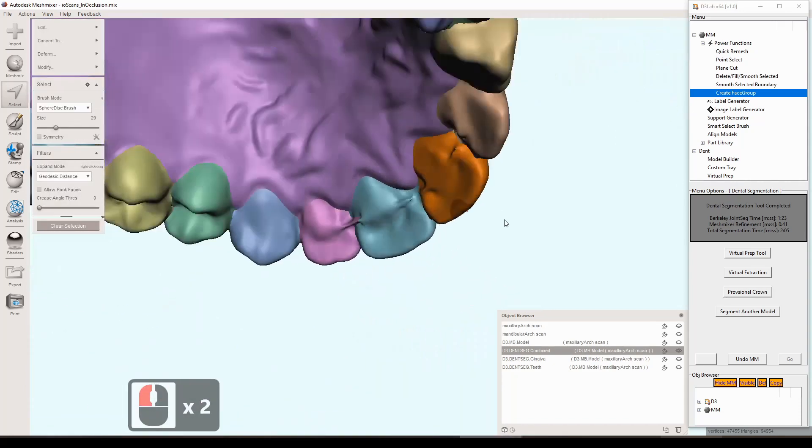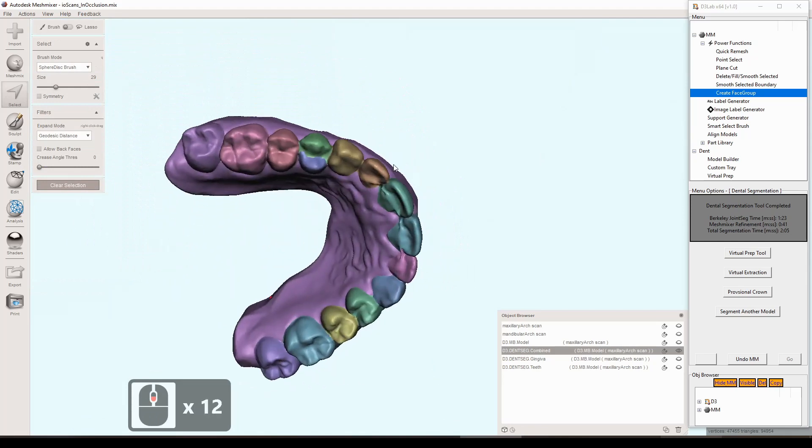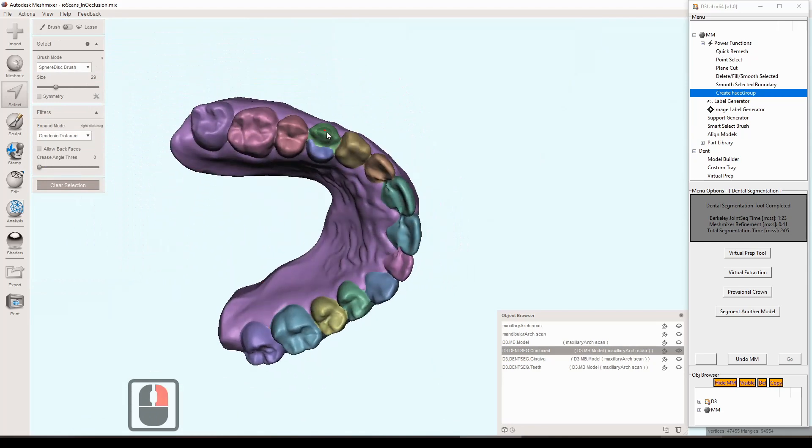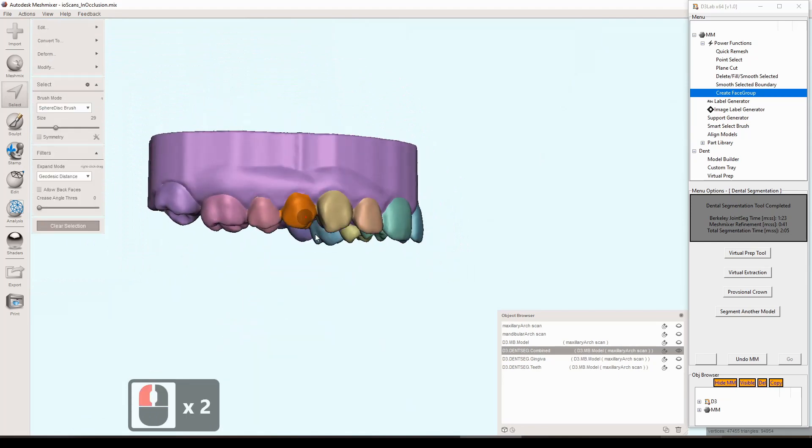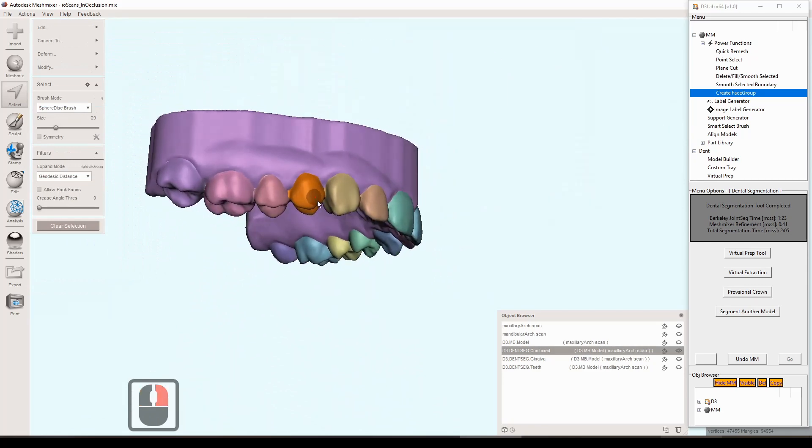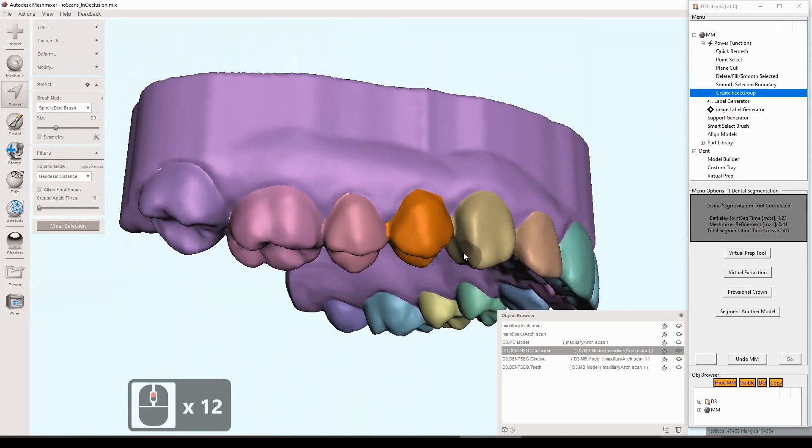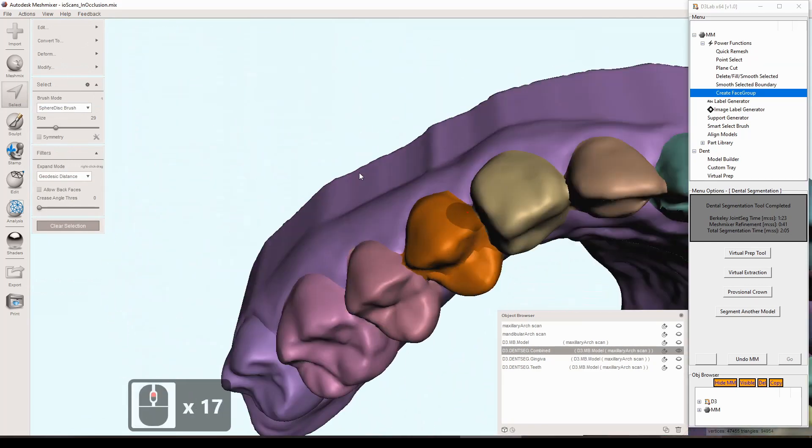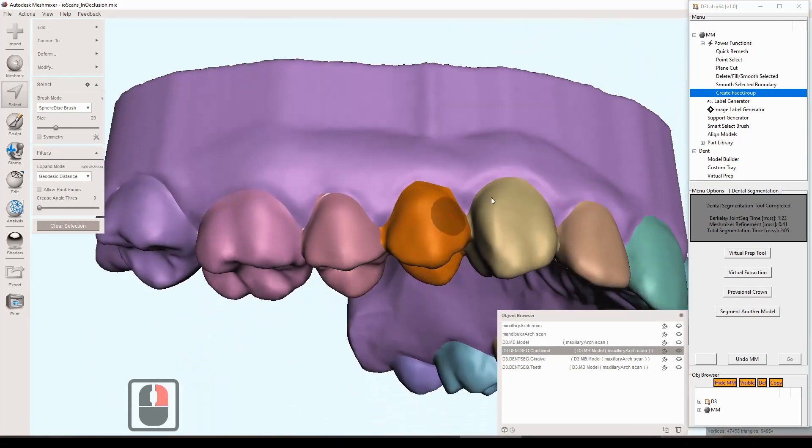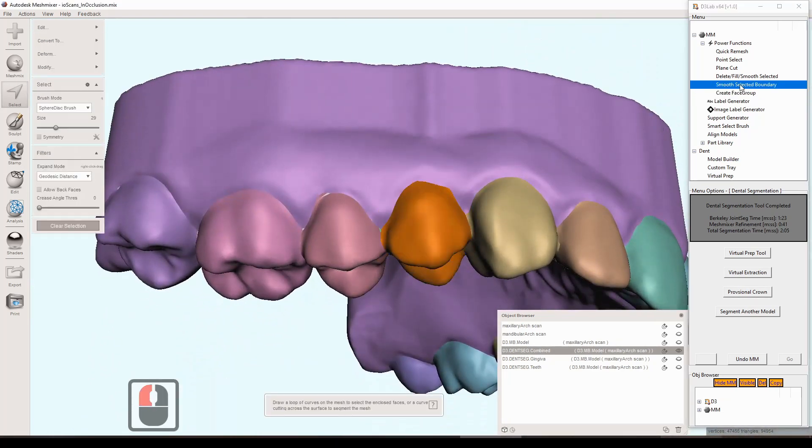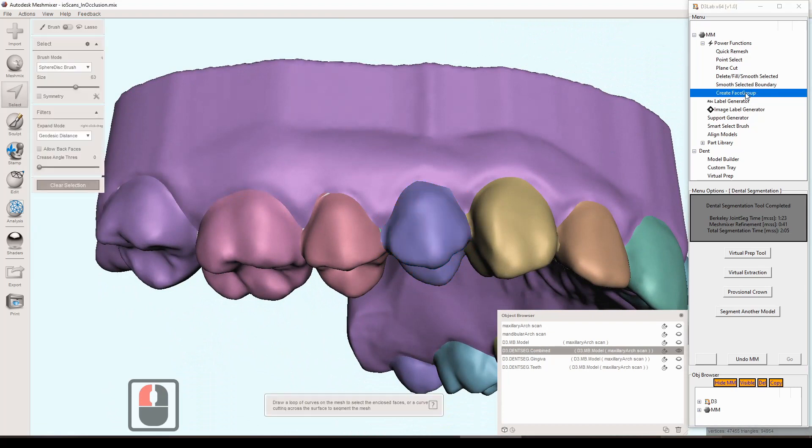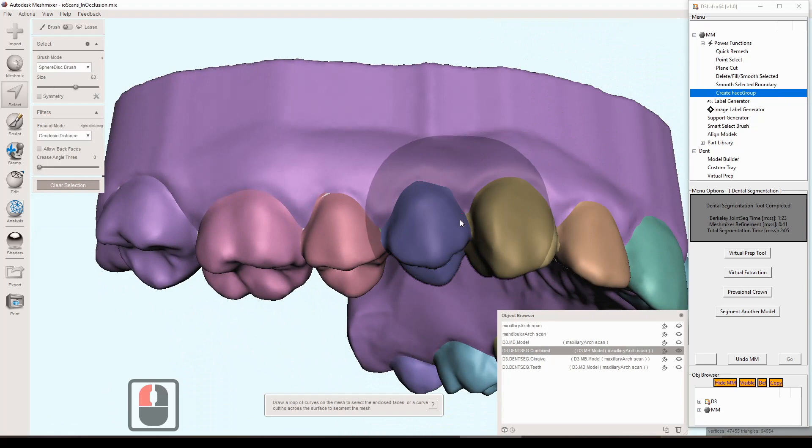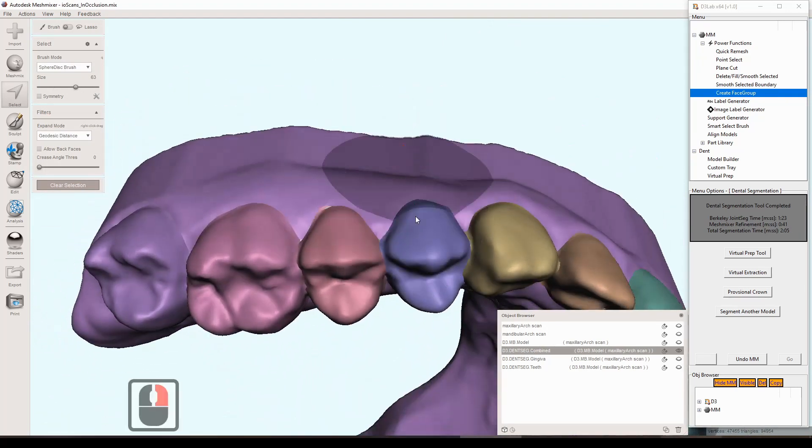I'll go through, there's a couple more here. On this one it's broken into two different segments so just double click both segments, kind of taking a look making sure. It's all up to you how specific you want to be, you can remove a little bit more if you want, but for me I'm just going through it quickly. So I do the smooth again, smooth selected boundary, and then create face group and now those two segments are combined into one.